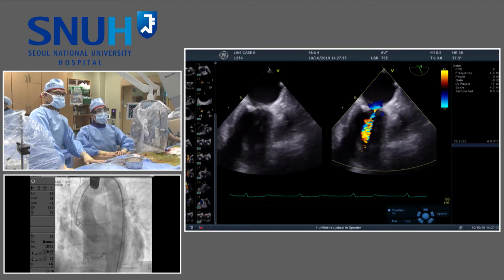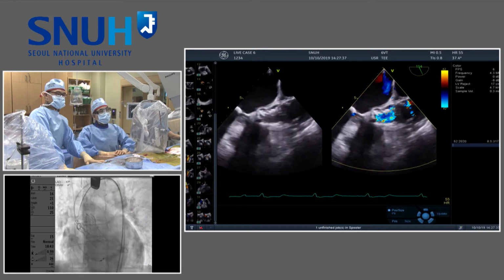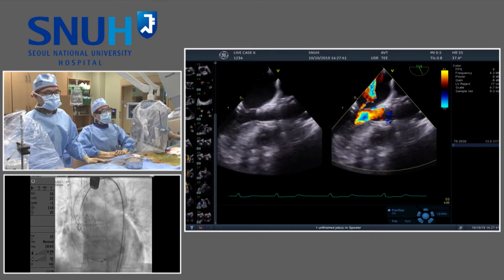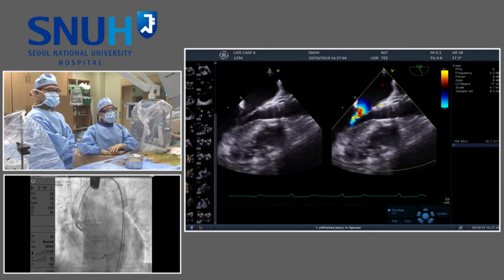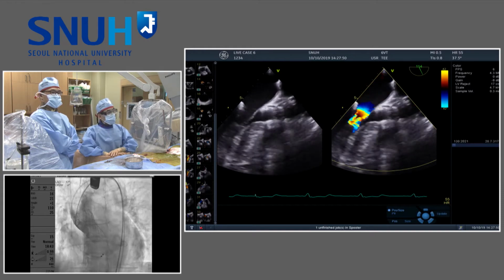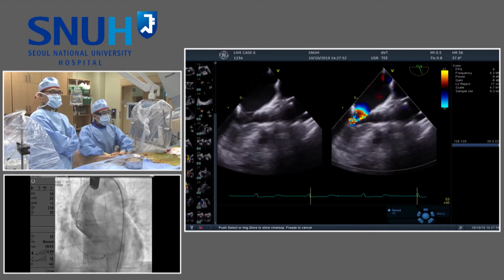Well, this is an alert for all of us. You know, I always say that the main predictor of pacemaker implantation after TAVI is not the depth of implantation and not the LBBB. It's who is the electrophysiologist in your department. Who is the one who decides? So we need more data, no doubt about it.